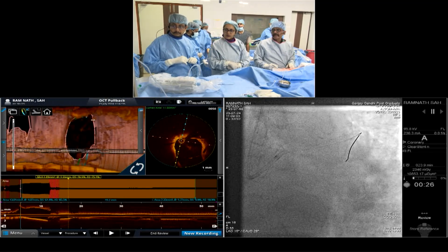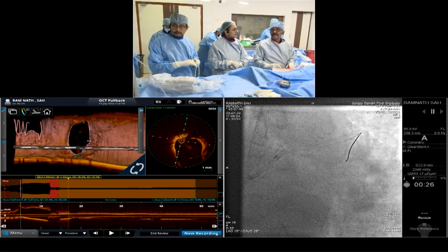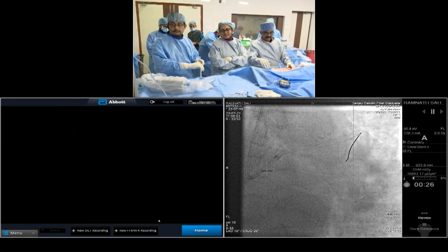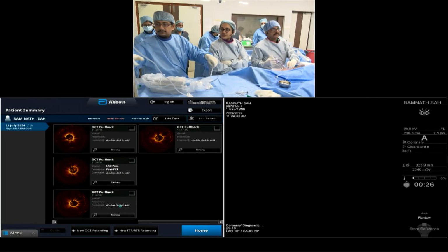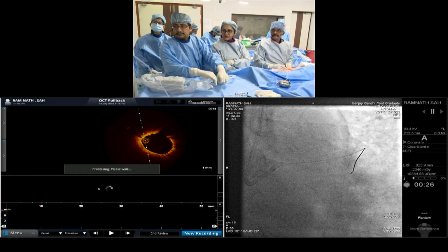And I think, as you rightly said, after this imaging you start believing that ostial placement is not as easy as it seems on fluoro angiographically. Maybe it would have been done with the left main to LAD. Can we have the LCX ostia view? Did you look at that LCX ostia, a flying view? Is this the final view?